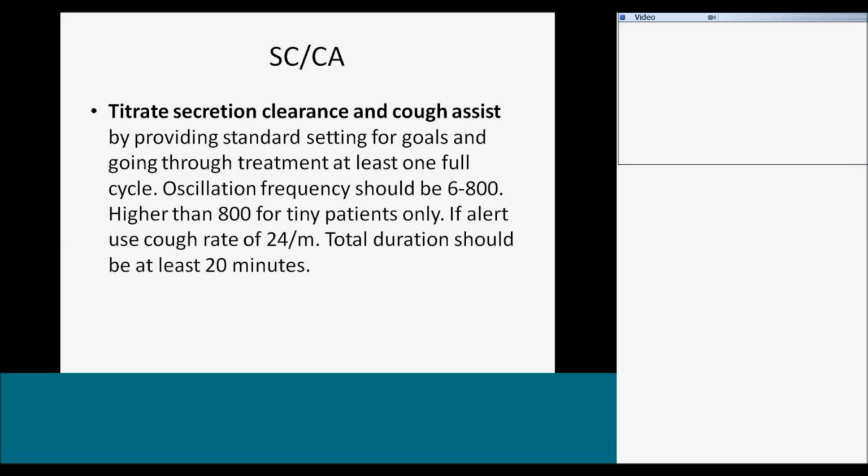It goes as high as 1,200. But for adults, that's a very rare setting selection. You're just not going to have much effect, or as much effect as you would like, thoracically at that setting. But for your infants, 1,000 to 1,200 is perfectly acceptable.